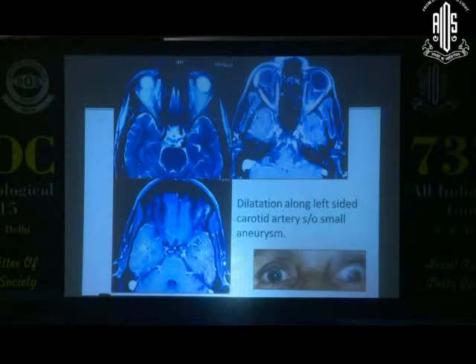You always go back to the base images, which are the finer sections in which you can make a better assessment of the aneurysm, its neck, whether it's actually clippable or whether the patient has to go to a neurosurgery. So this is what it was, a PCOM aneurysm in one of the contrast enhanced images.